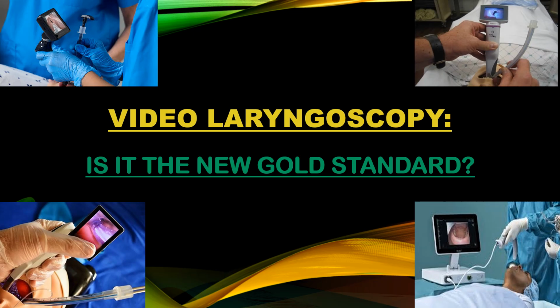Everyone in the room sees what you see. Training becomes real time. Manage the difficult airway with confidence. Better glottic view. Better tube delivery. Better outcomes. Question the standard.